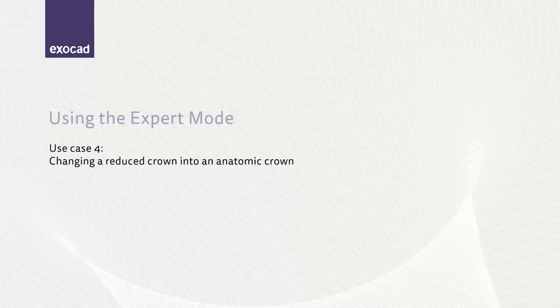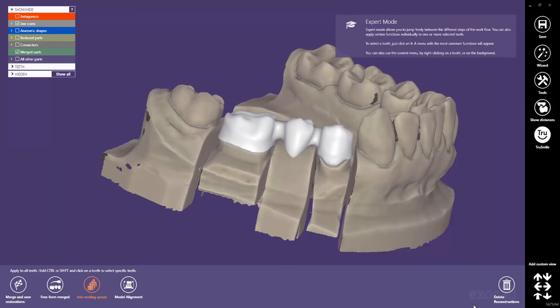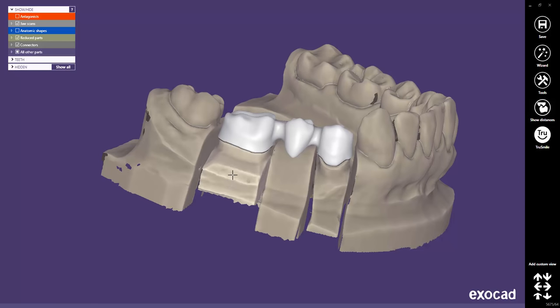The next sample case will show how to change a reduced tooth into a full anatomic crown. Again, I have loaded a saved scene file from the DentalDB. Let's switch again to the Expert Mode. Once again, we have to delete the constructed parts to unlock all work steps. Imagine you would like to switch tooth 46 into a full contour crown. As we already designed an anatomical tooth before it has been reduced in the initial case, we might use this initial design.